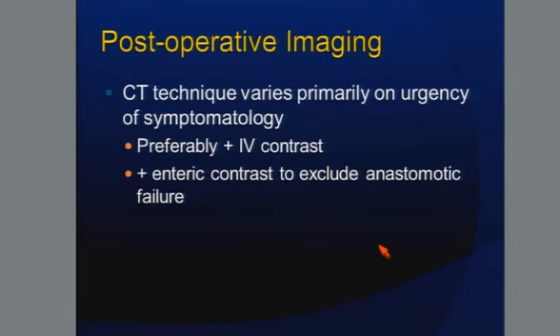If you're imaging the patient with CT, the technique will vary significantly on what you want to know. I don't know how many of you are still using oral contrast routinely. My institution has given up oral contrast in routine imaging of the abdomen and pelvis, but we do like it in the setting of luminal imaging in a patient who we are worried about a leak. We prefer to use intravenous contrast.